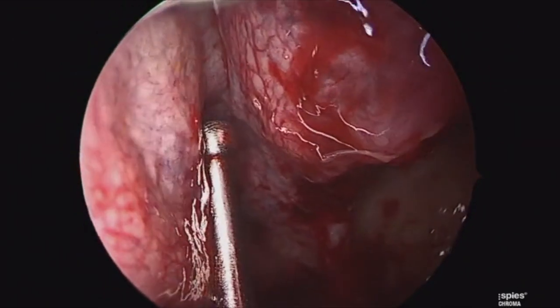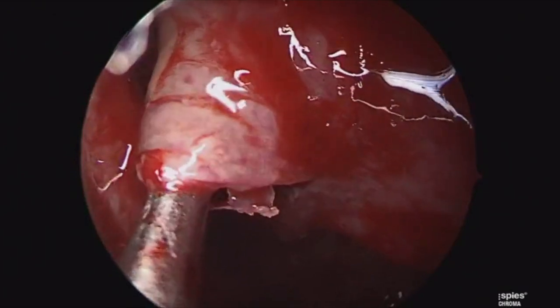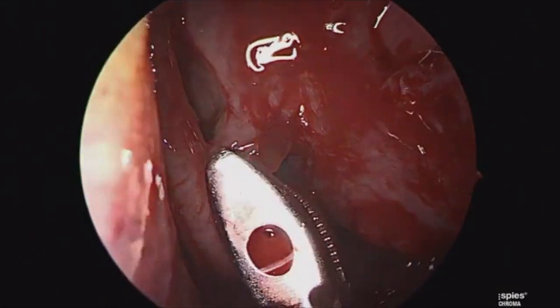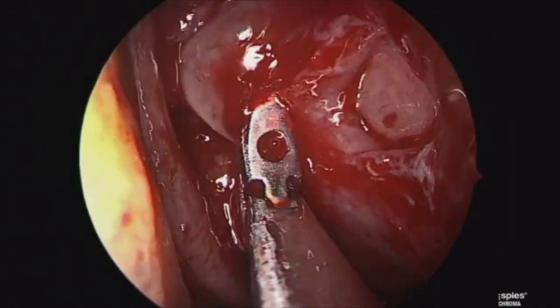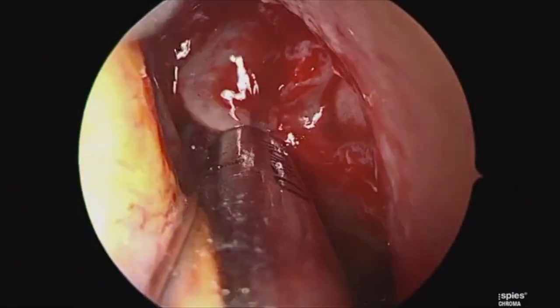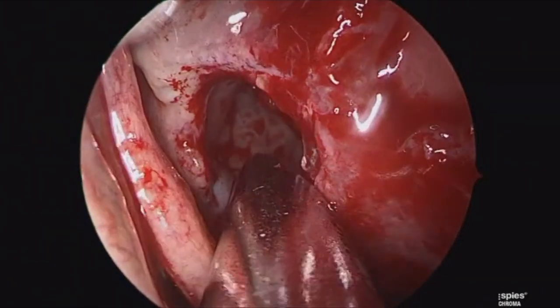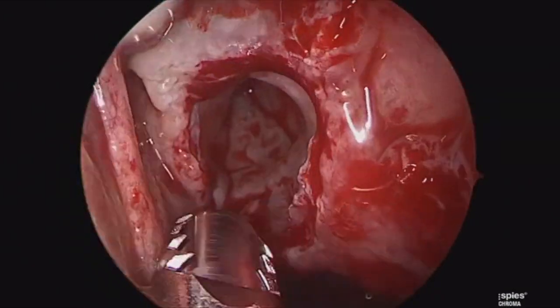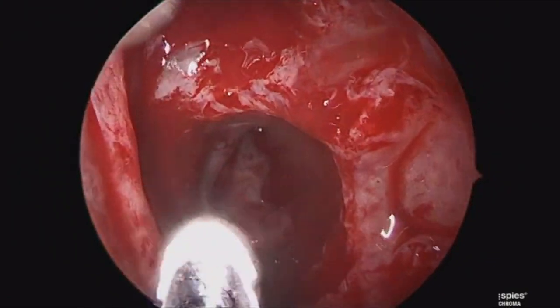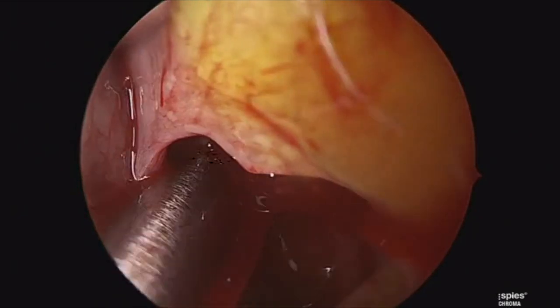We will now turn our attention towards the ethmoidectomy. Here we are identifying the ethmoid bulla in its natural outflow tract, which is in the posterior and inferior aspect just in front of the basal lamella. We're fracturing that forward with a maxillary ball probe, and then using a 45-degree throughcut to take down the face of the ethmoid bulla. When dissecting through the ethmoid bulla, the goal is to identify the lamina papyracea safely, which will guide further dissection as you work more posteriorly. Here we are using a microdebrider, taking down more of the face of that as well as some additional polypoid mucosa. You can begin to see the lamina papyracea on the lateral aspect within the cell. We're taking down the more superior aspect of the cell with a two-millimeter outgoing curette, working parallel to the orbit.